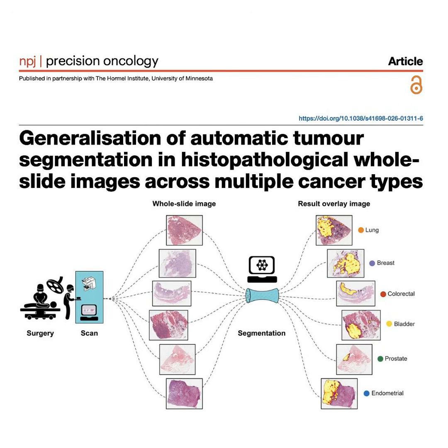But as you might suspect, that exact cleanup mechanism creates a really unique vulnerability. It definitely does. Because what happens if that post-processing filter accidentally scrubs out a real but very faint signal? Yeah. Like, what if the AI is 60% sure it's cancer, but because it's physically isolated and doesn't touch a 90% anchor, the hysteresis thresholding just erases it completely? Well, that vulnerability was exposed almost immediately during their real-world validation.